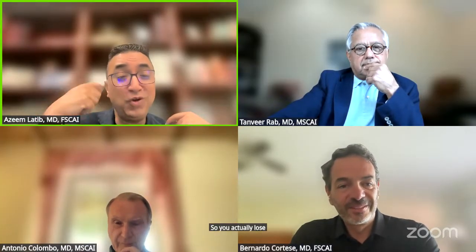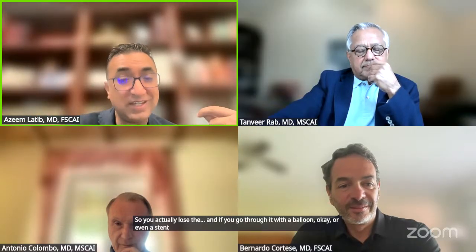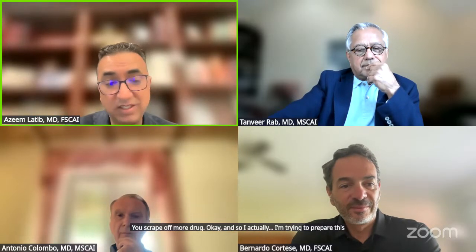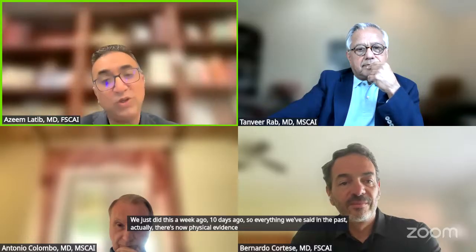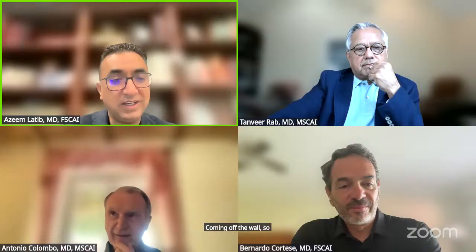So you actually lose the drug. And if you go through it with a balloon, or even an undeployed stent, you scrape off more drug. I'm trying to prepare this. We just did this a week ago, 10 days ago. So everything we've said in the past, there's now physical evidence I can show you, and you see the drug coming off the wall. So I do think that's very important.